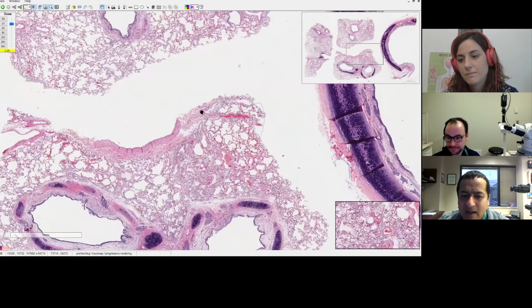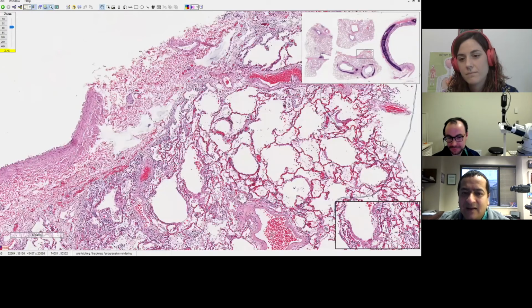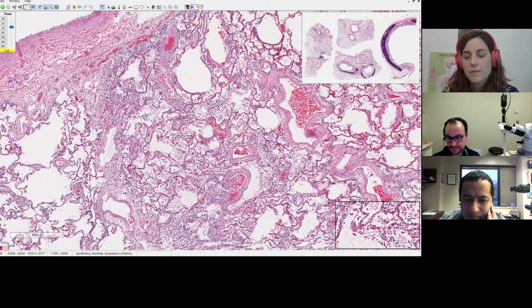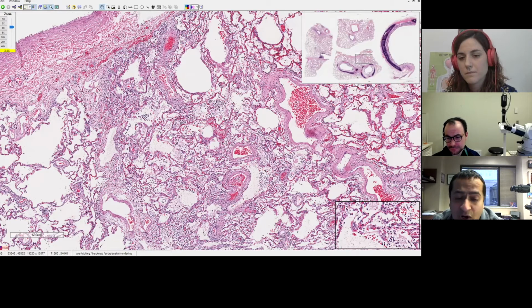But I think this is really the most classic, pure COVID DAD case you will see. Did you perform immunohistochemistry in this case? We did. Immunohistochemistry showed a CD3 positive T cell lymphocytosis and a little bit of both CD4 and CD8, and that's about all I did. Later, when we looked at the SARS-CoV-2, we found SARS-CoV-2 viral particles by in situ hybridization and immunohistochemistry in the lung, in the pneumocytes, but not in the kidney and other organs. So it was only in the lung.